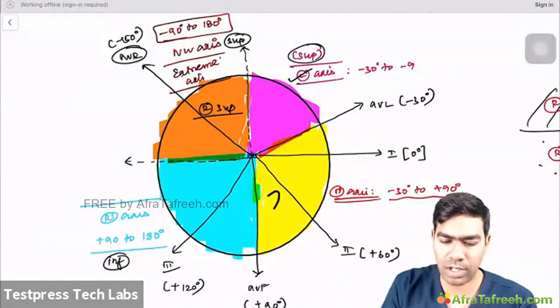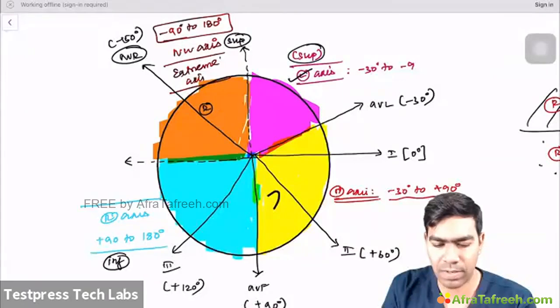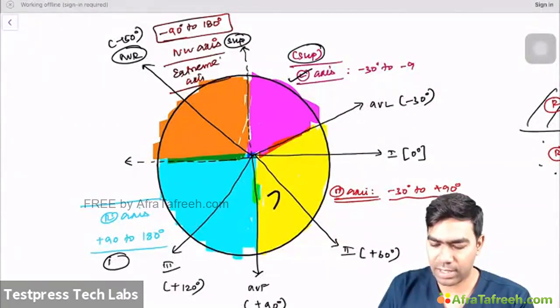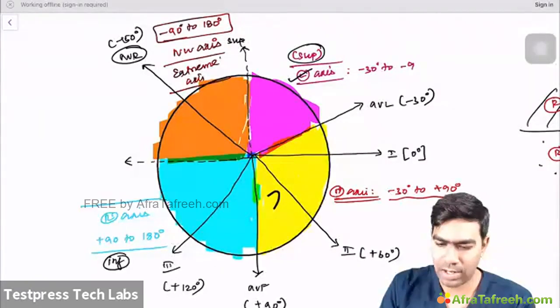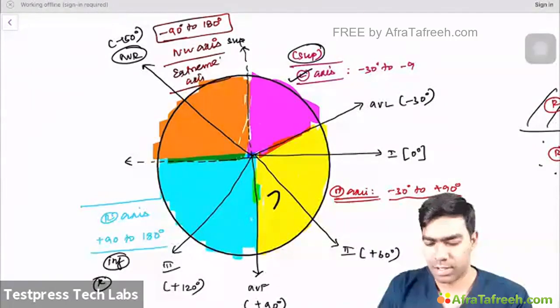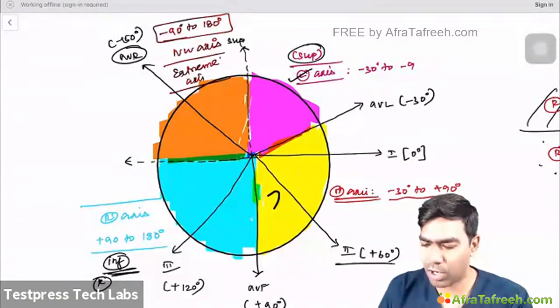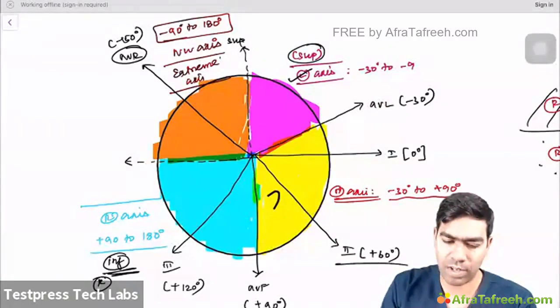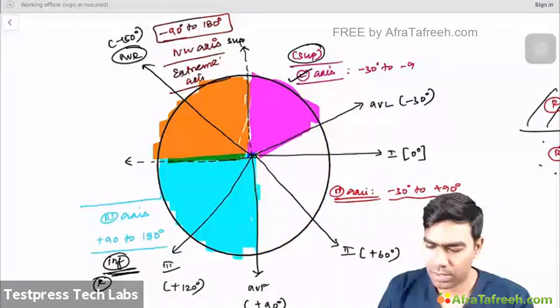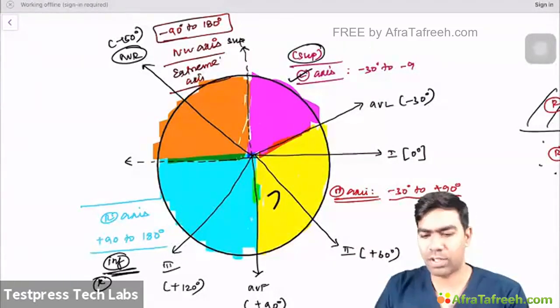These kinds of terminologies will be confusing when you read a textbook, but when I tell it, it will become easier. That's why I want to tell this. So don't get confused between superior and inferior axis. Similarly, right axis is an inferior axis only, no doubt about that. But you can clearly see it's a right inferior axis. That's why right axis deviation is sometimes referred to as an inferior axis. Similarly, remember, normal axis can be left inferior axis or left superior axis. You should be a little careful with the terminologies we are discussing.